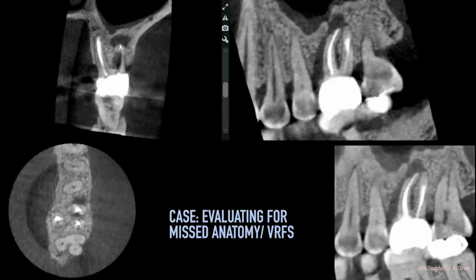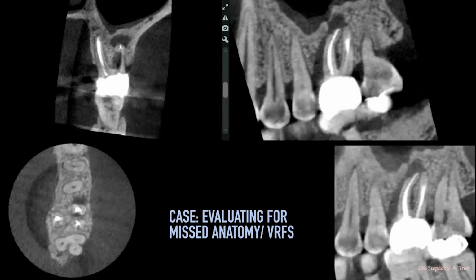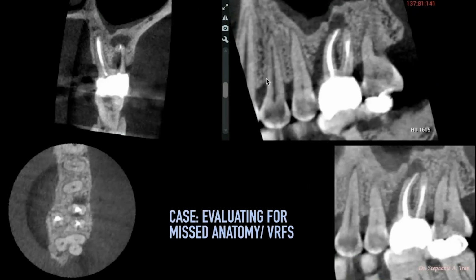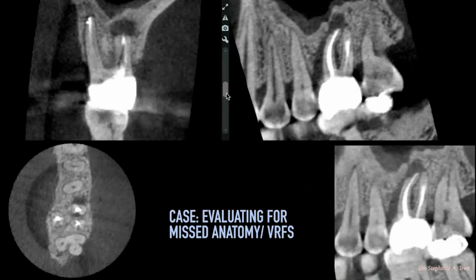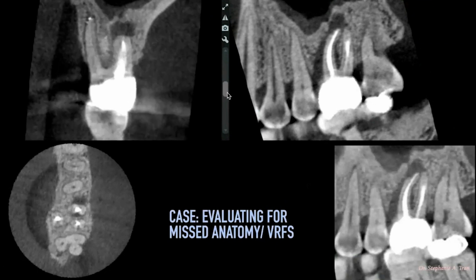So with such severe mid-root bone loss, we can also see that the root filling material is very close to the root wall. So there's very, very thin remaining root structure. So we can see the bone loss, the periapical radiolucency, that bone loss in the furcation area and mid-root level, and then most importantly, as we're scanning along it, that it's a very, very thin remaining root structure. That tells us, unfortunately, this tooth did have a vertical root fracture.